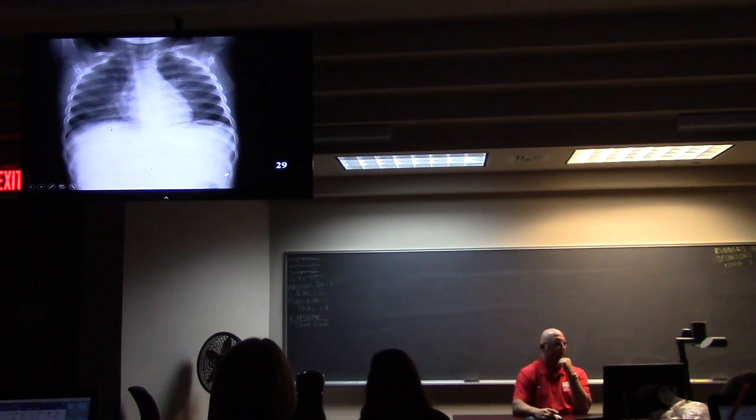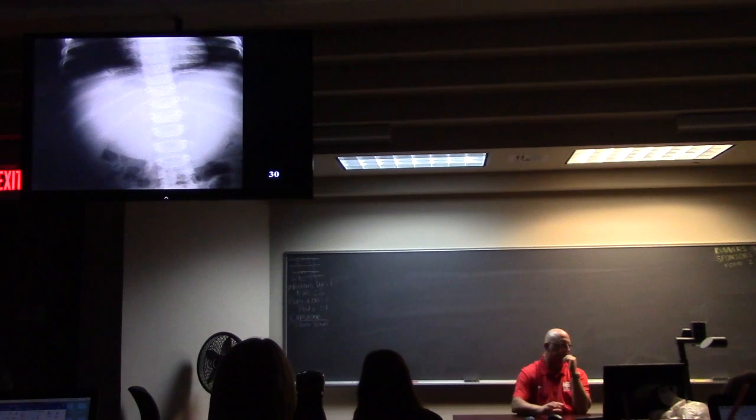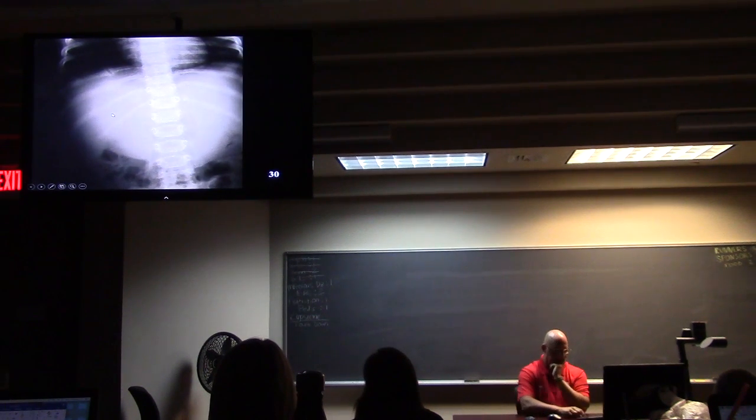Maybe we should do a tomogram. It's called a tomogram or a Bucky shot, where we hone in on just that area. Let's do that. Oh, there's another fracture. Different stages of healing. That's challenges. Good call.